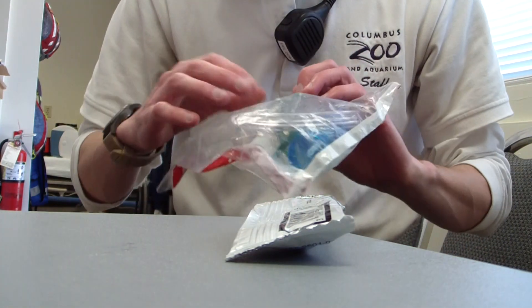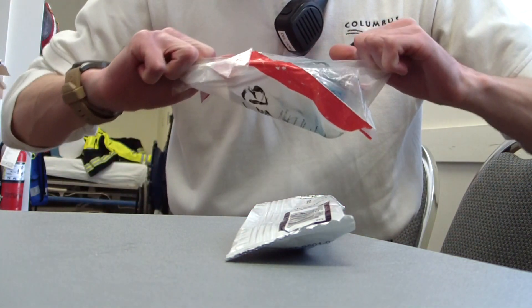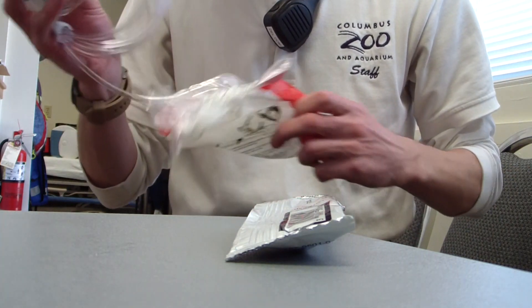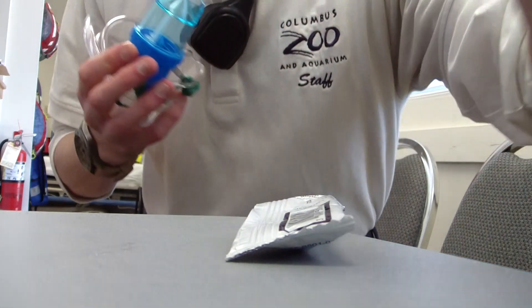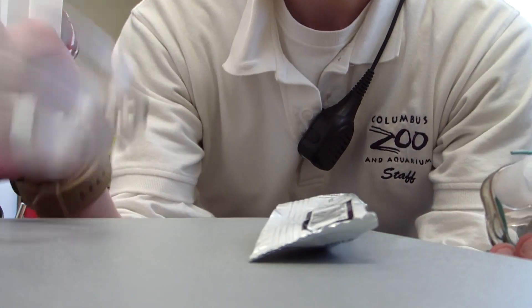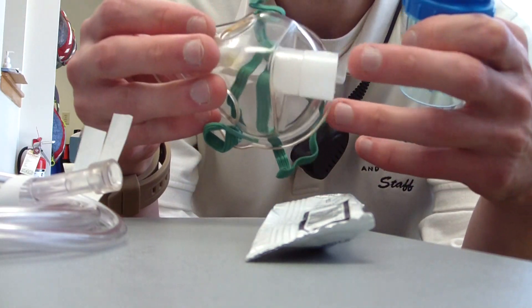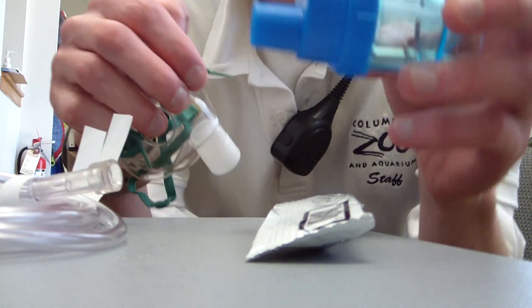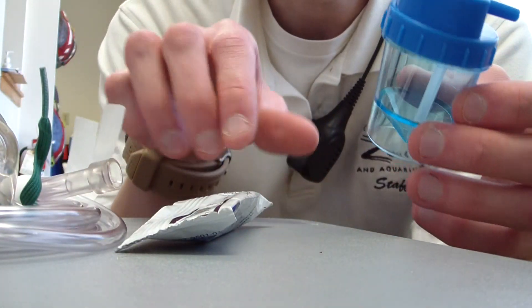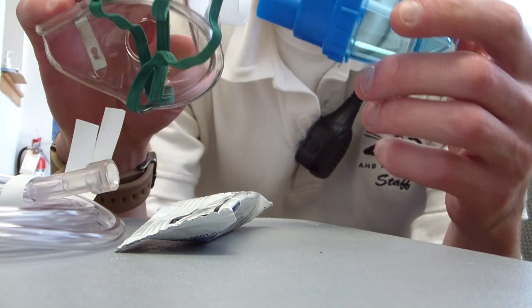I'm going to be using a pediatric nebulizer — that's all I have right now. You've got three pieces here: you have your oxygen tubing, you have your face mask with a little piece at the bottom, and you have the unit in which all of the albuterol actually goes into and then plugs into the face mask.